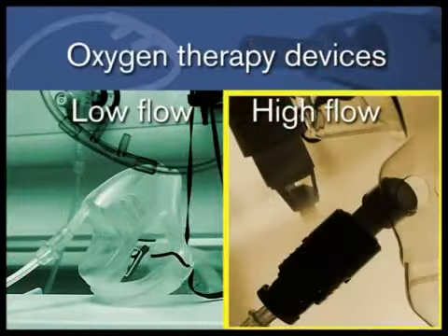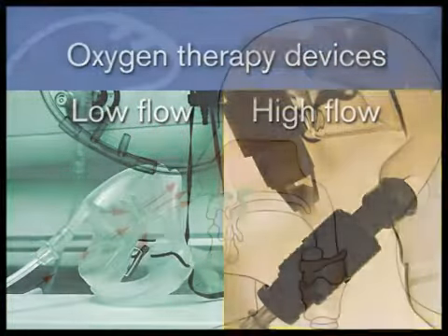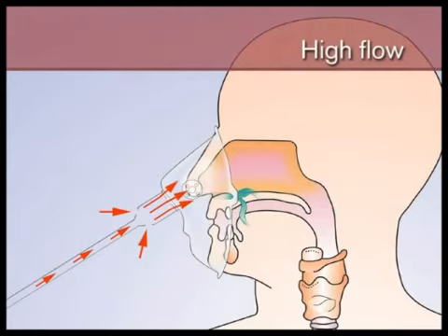Now let's look at the high-flow devices. These provide sufficient flow of gas to meet all of the patient's minute ventilation requirements. Let's look at when a high-flow device might be more appropriate.